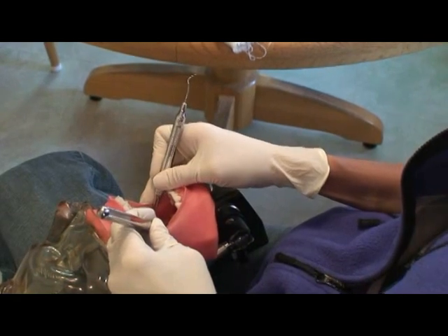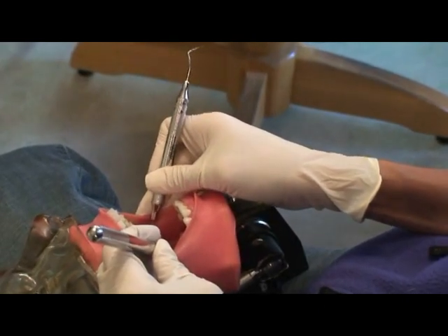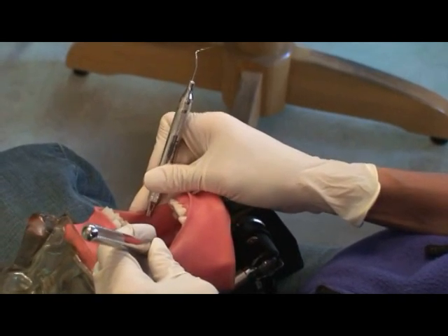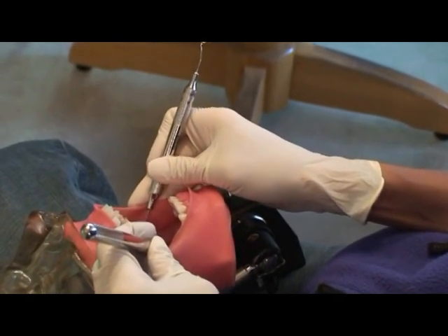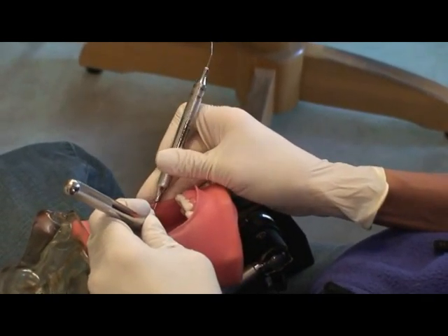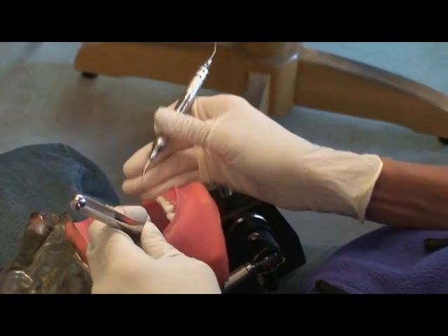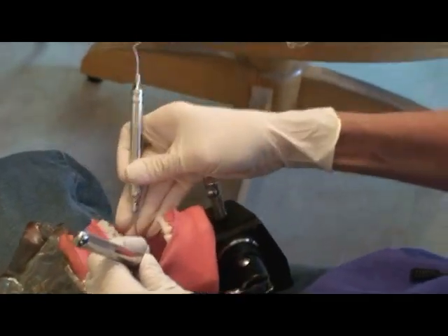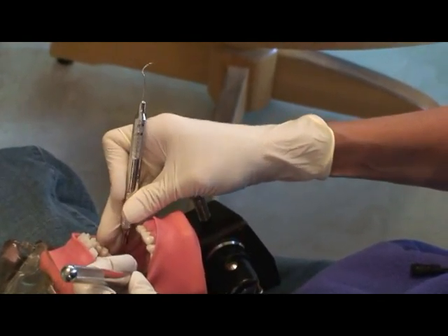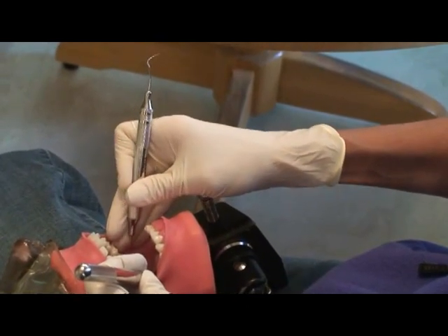Upper left lingual, cup the chin. Intraoral fulcrum is acceptable as well, and I'll show both. Now for an intraoral fulcrum, you would fulcrum directly on the molars. But I think extraoral will be easier at this time.